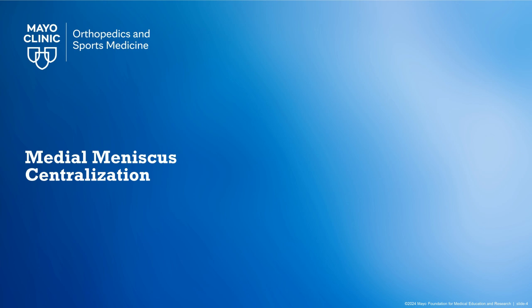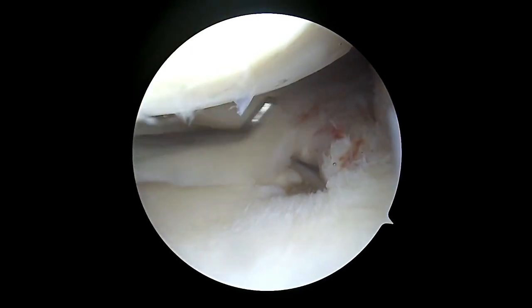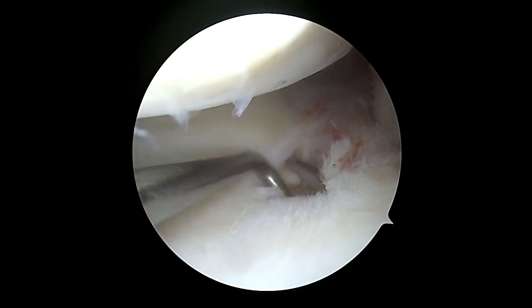To illustrate the application of this technique, we will start with a demonstration of medial meniscus centralization in the setting of a posterior root tear. After a standard diagnostic arthroscopic evaluation, the meniscus posterior root is evaluated and found to be torn, leading to meniscal extrusion.